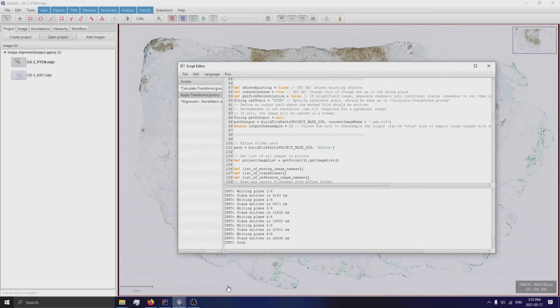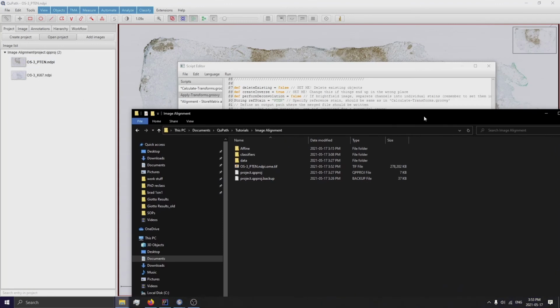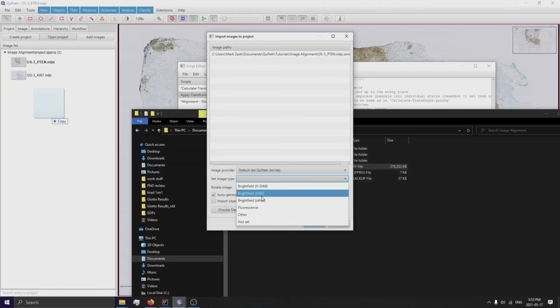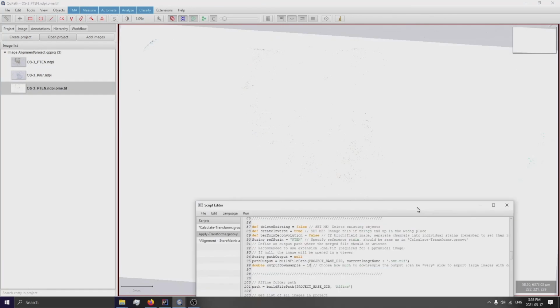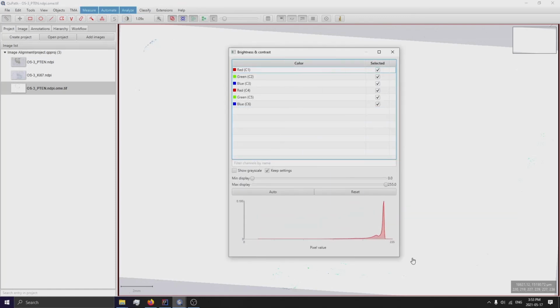And so we ran it, and we now have an image written out. Our image is this. Now we can take this OME-TIFF, load it into QuPath to see if it reads. Want to make sure I'm recording. Yep. Let's set the image type to other, doesn't really matter. And voila, we now have the aligned and appended image.